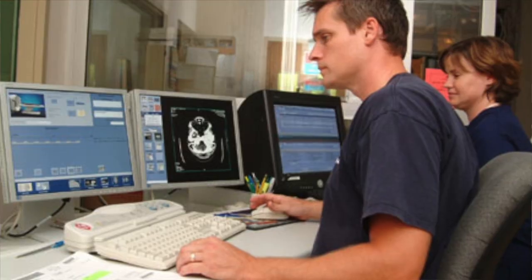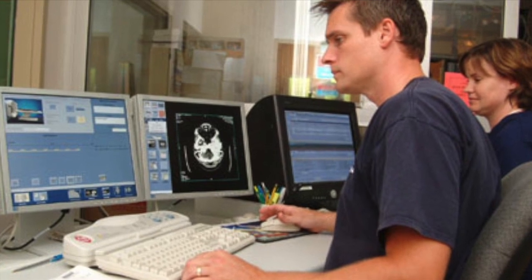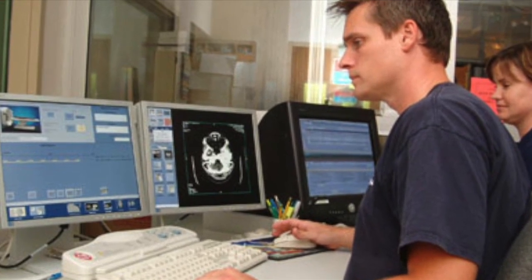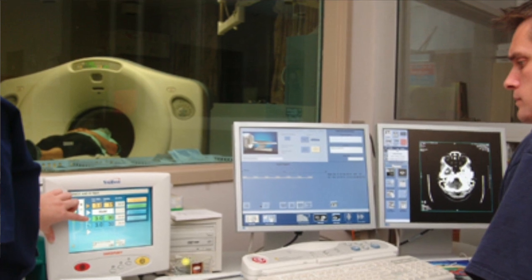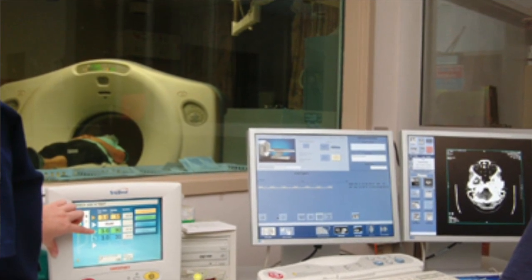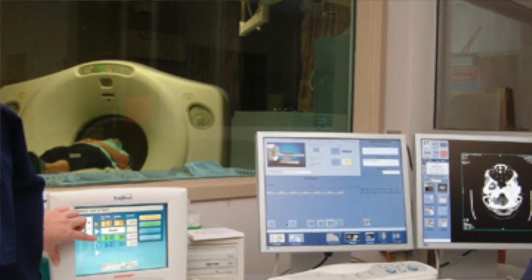A CAT scan is essentially a way to get three-dimensional X-ray information. It images the human body in slices — like very thin slices of bread — and presents those two-dimensional images stacked to form the full three-dimensional picture of the patient. So it's basically 3D X-ray vision.